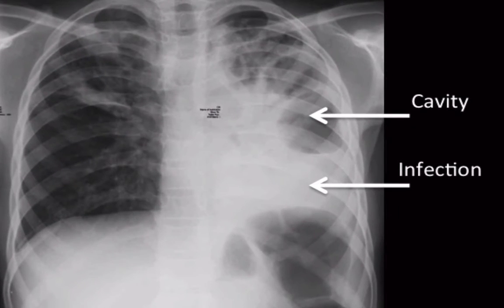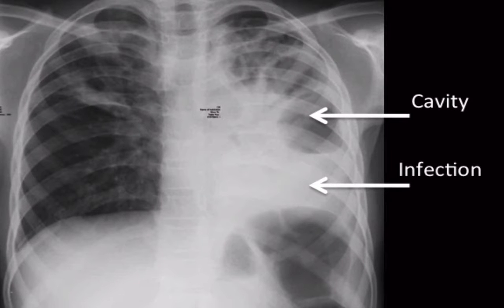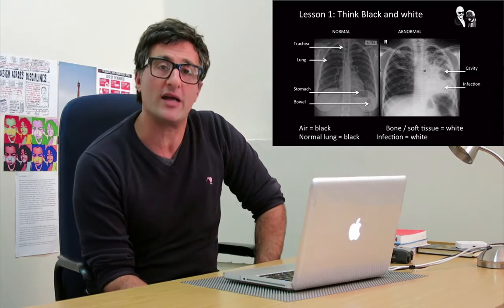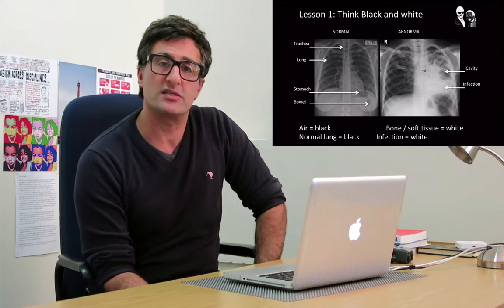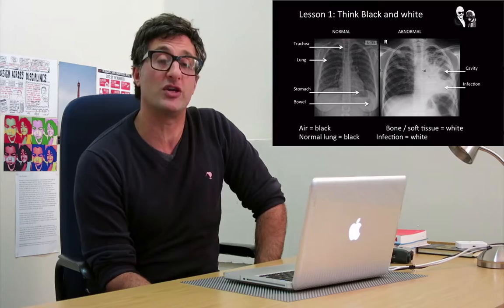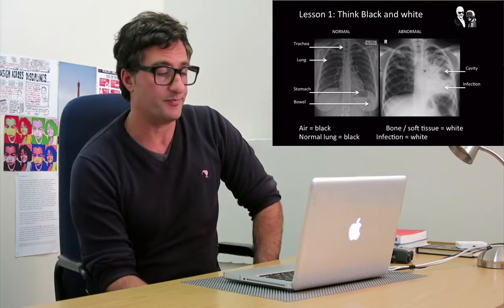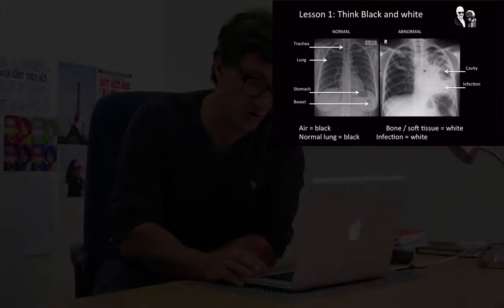An abnormal chest x-ray demonstrates left-sided disease in the lower portion of the lung — that's all become white. In the center there appears a cavity containing air, which is once again black. So pathological things may be black or white depending. It's simply much easier to consider that you expect the lung to be black, and once it's white it's abnormal. That's a very simple lesson to learn.